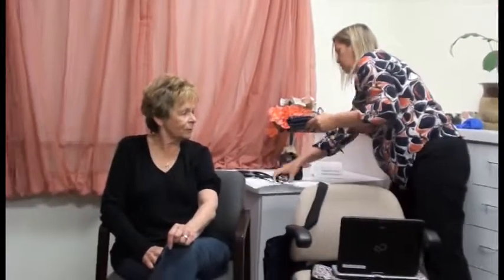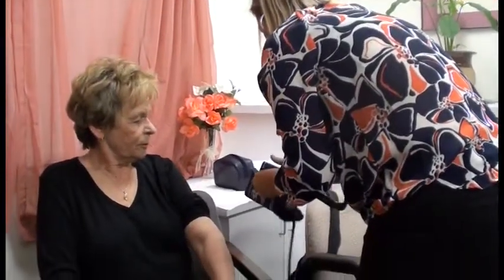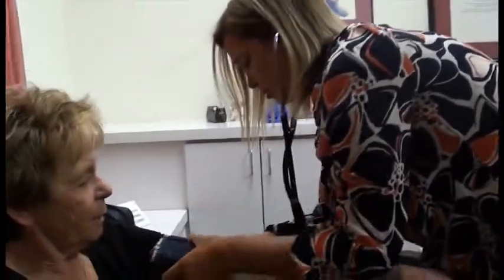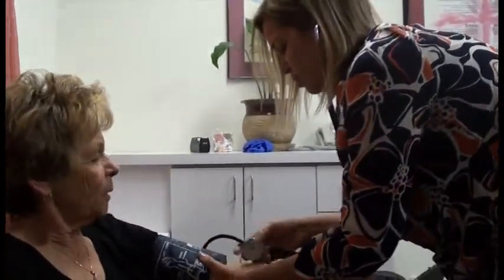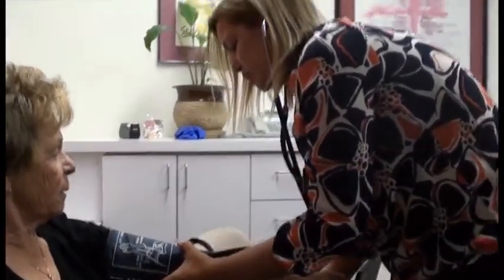So let me just put in my password here. While this warms up, we're going to go ahead and start taking your vital signs. Any kind of new issues you want to bring to my attention? No, I've been feeling really good. Let me go ahead and clean this off with my alcohol. Do you know where your blood pressure usually runs? It's been fluctuating a lot, so I've been on some new medication. Oh, new medication. Okay. Give me a second here.